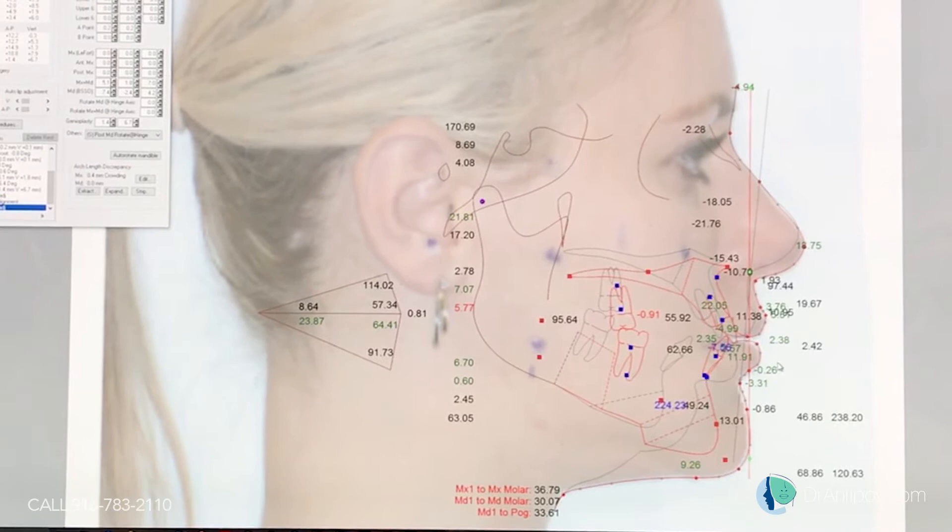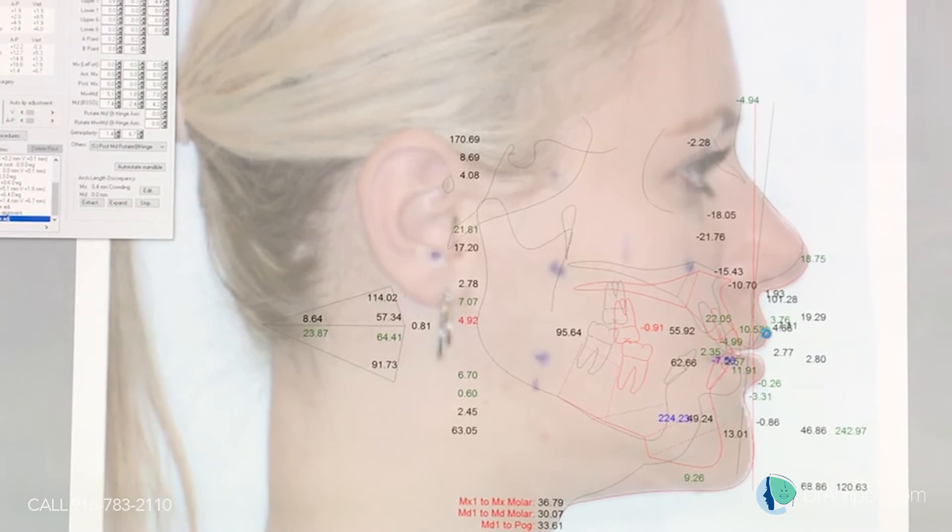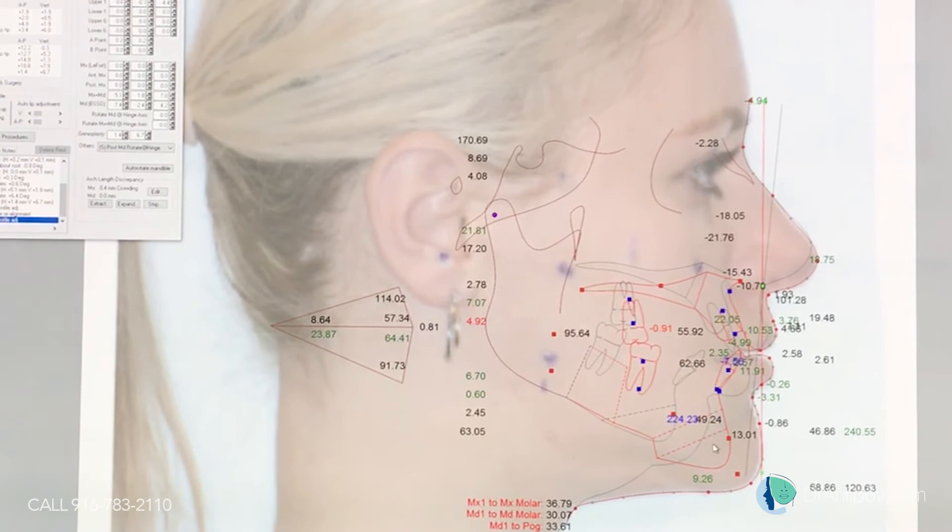With the rhinoplasty, we're going to lengthen the nose and shorten the lip a little bit - yes, make the lip a little shorter.